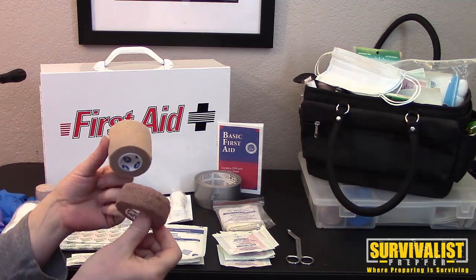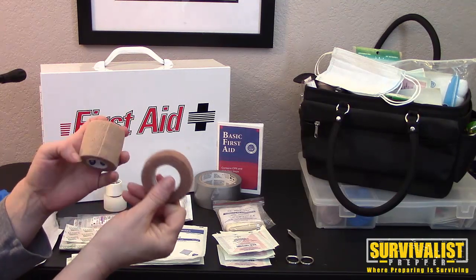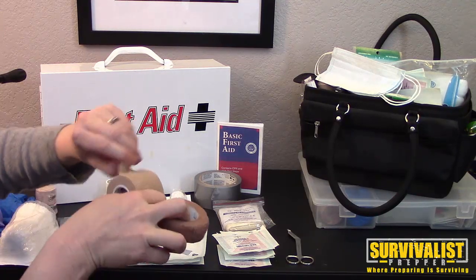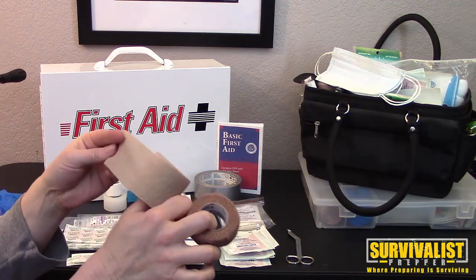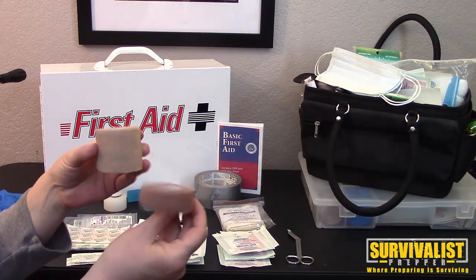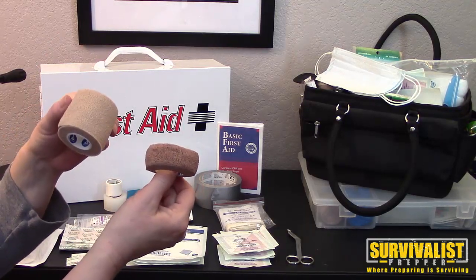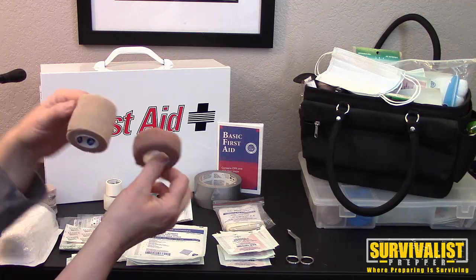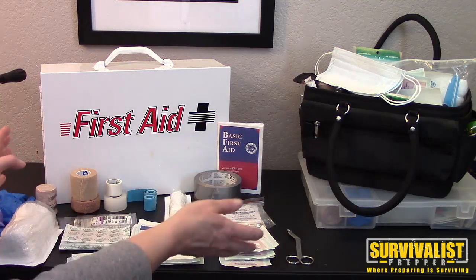These are adhesive dressings — this is the people version, and this is also a people version. Coban is made by 3M, and the equivalent is vet wrap, which can be cheaper — sometimes you can find it for 79 cents a roll. They come in different sizes; these two sizes are my favorites because you can use them on multiple different areas of the body. They're elastic and won't stick to skin, but they can be constrictive — we'll cover that in a future video.